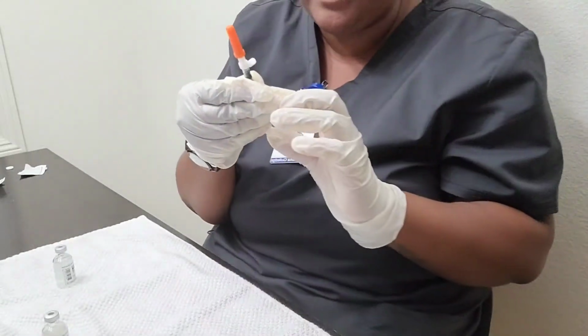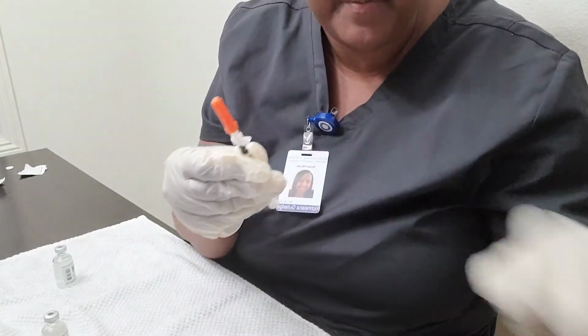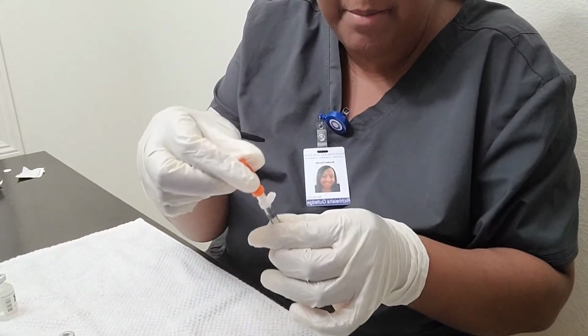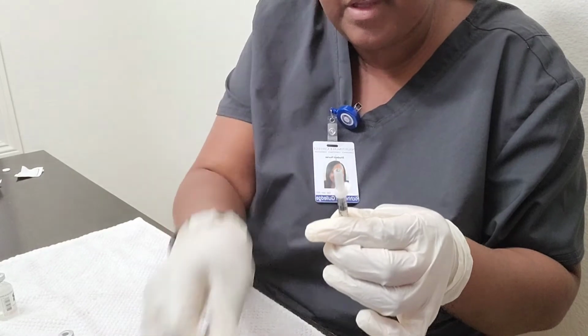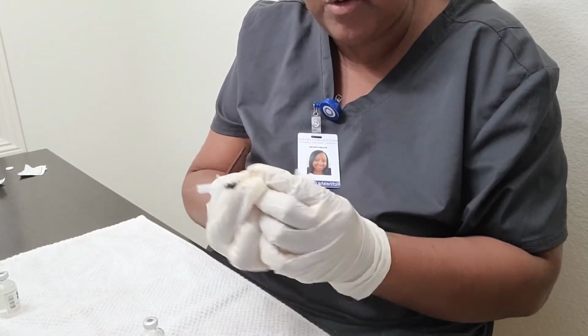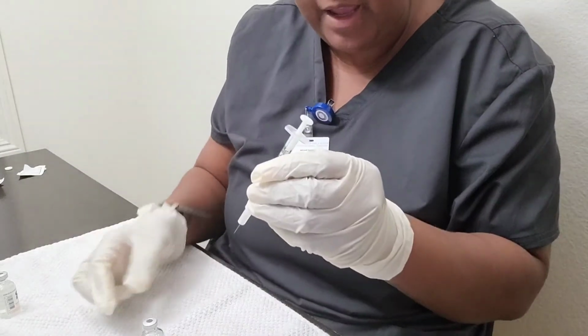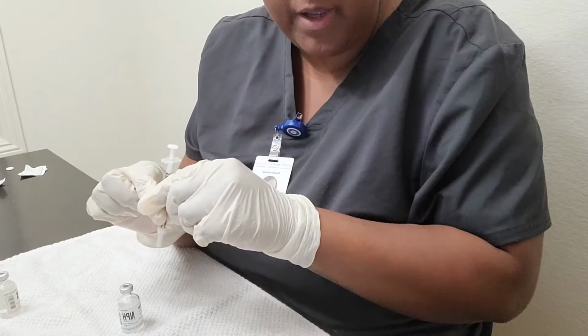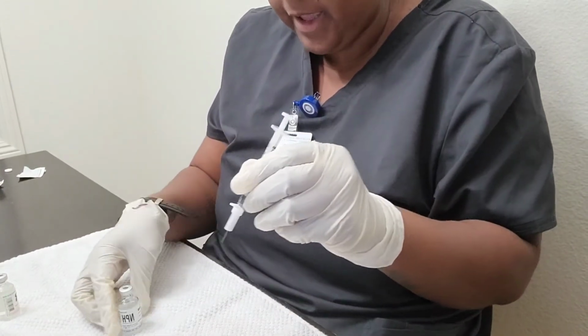Okay, so that is 8 units. I will now go ahead and take the top off. Okay, and I will hold the needle with my dominant hand and stick it in. Then I will inject 8 units of air into the vial.